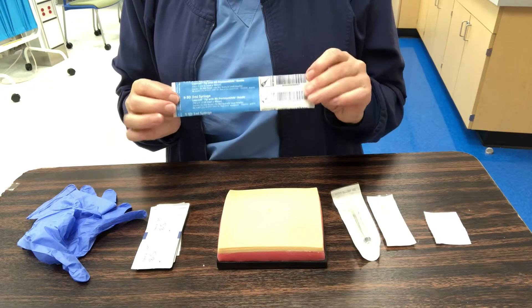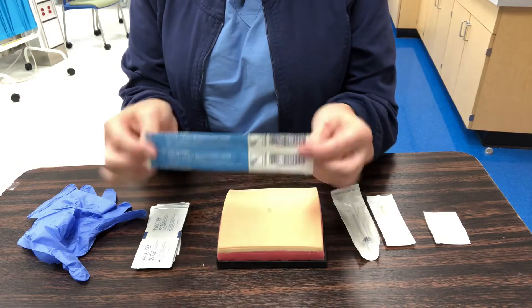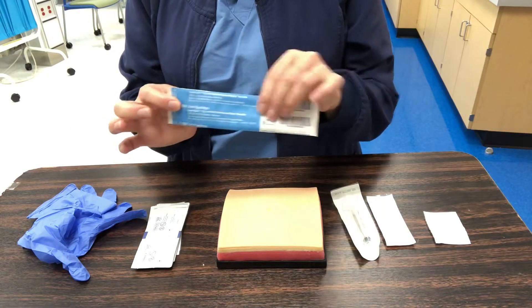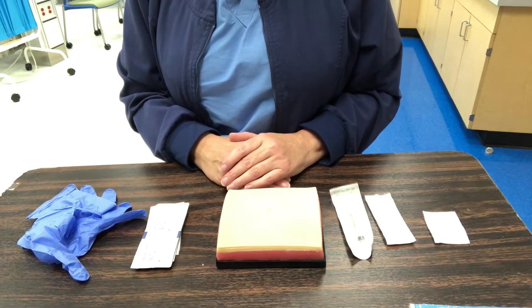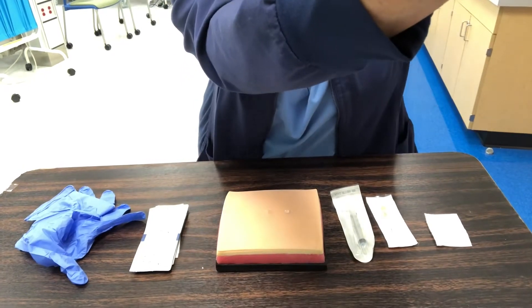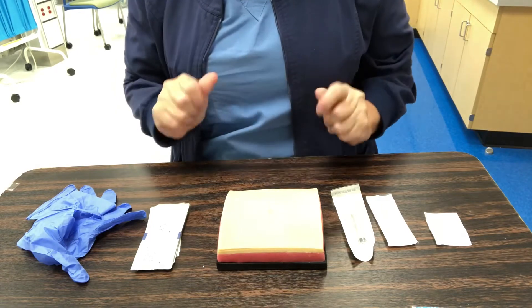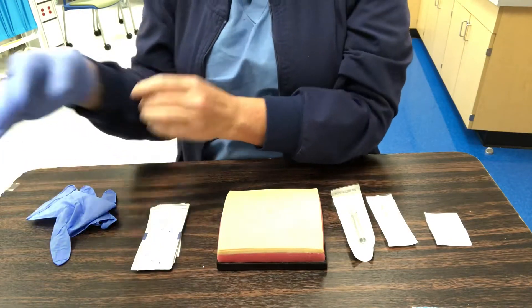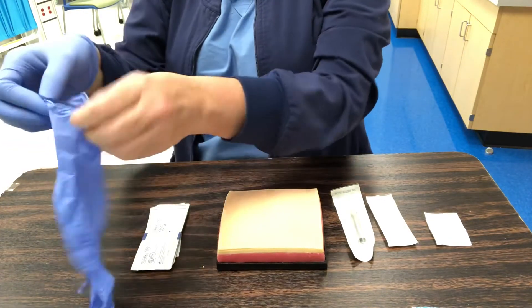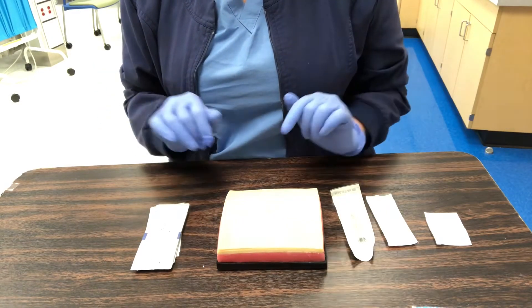This is an attached needle to the syringe, which is nice — packaged and ready to go — but I want a slightly smaller needle for this injection. I'll wash my hands using hand gel, then put on my gloves. I've already completed all six rights, checked the MAR three times, done two patient identifiers, and checked for allergies twice. I am ready to prepare and give the injection.